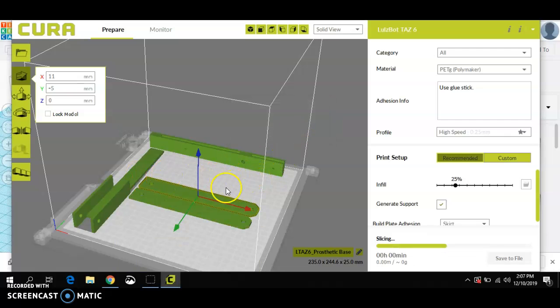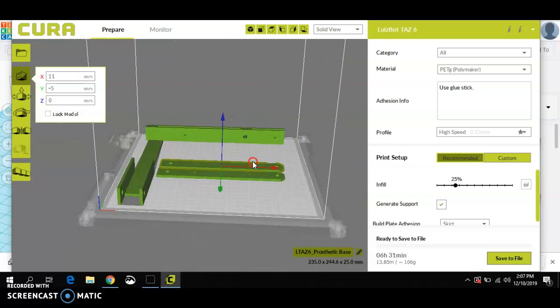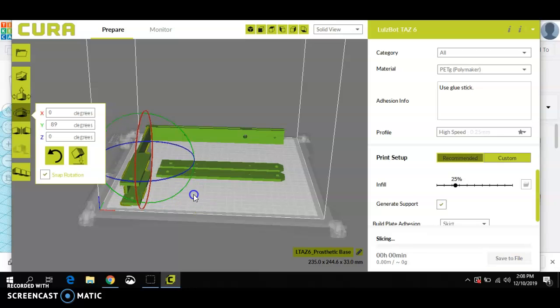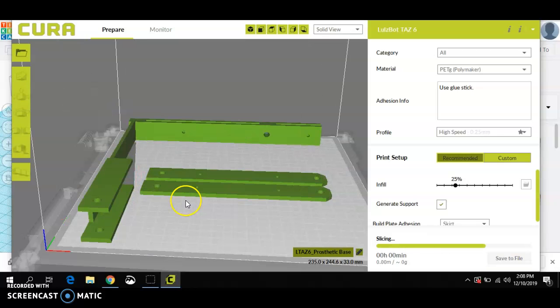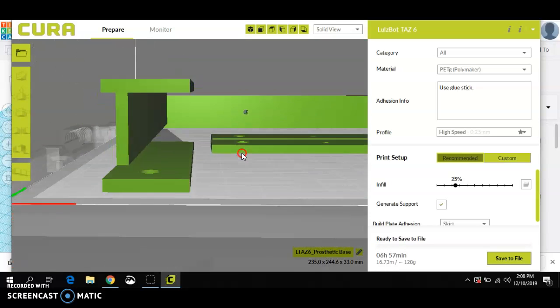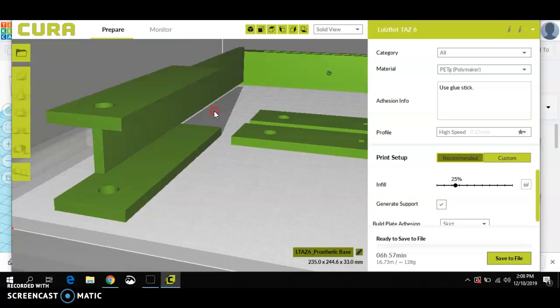All right, now just a couple of quick things. It really helps to use a mouse when navigating around Cura. I can move objects, multiply them as you've seen. I can change scale, which of course I don't want to do in this application. But I just want to rotate this 90 degrees to talk about how the 3D printer prints and something called infill. Okay, the 3D printer, this is red because this cannot be printed without support. The printer cannot print in outer space.